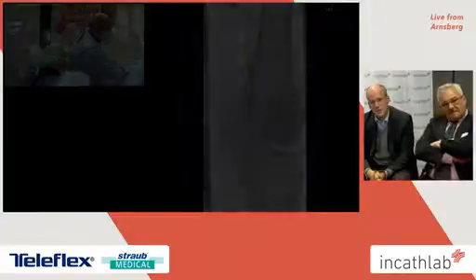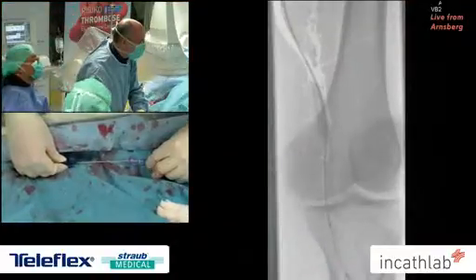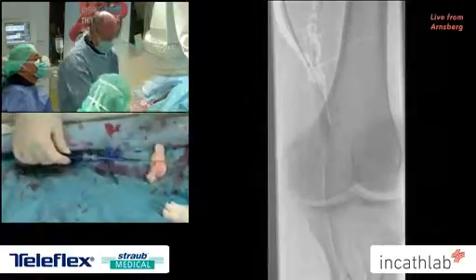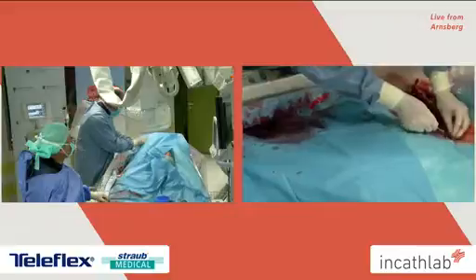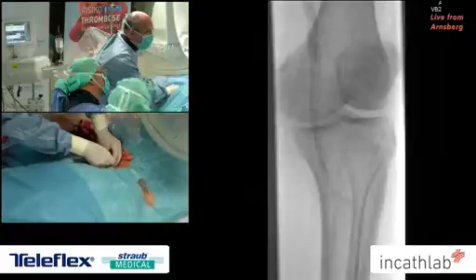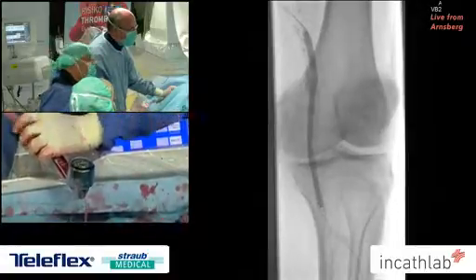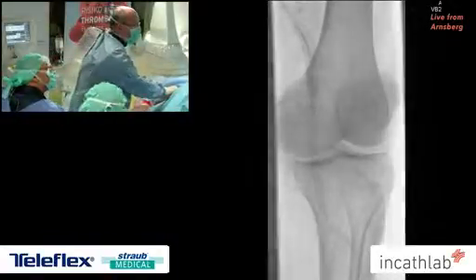So we need to scaffold. We implanted here a stent in the popliteal artery, the whole P1 to P3 segment, with a Biomimics stent. It seems to be a very good stent for this indication. We did a post dilatation with a DCB, and then went in with a debulking device, an atherectomy, to get out the organized material at the origin of the tibial arteries and the peroneal. We use the Phoenix system, and we'll see this in a second.